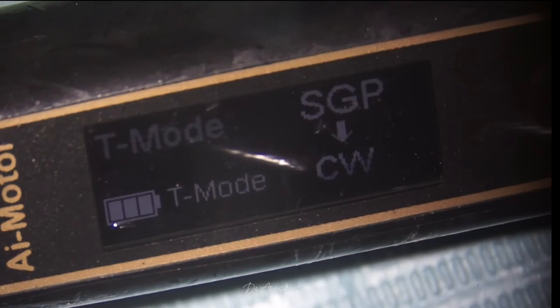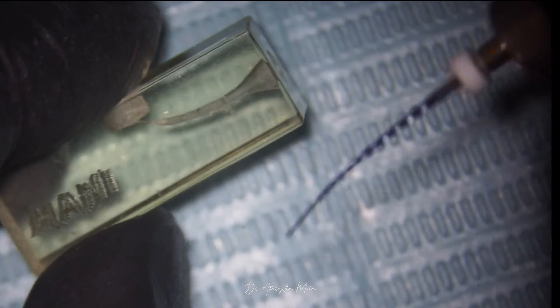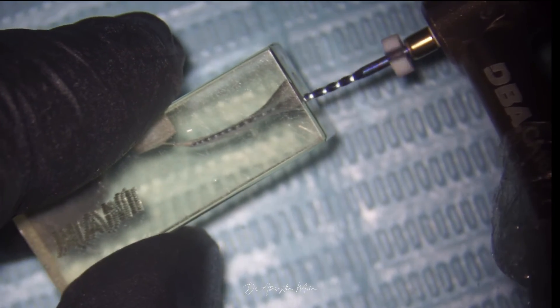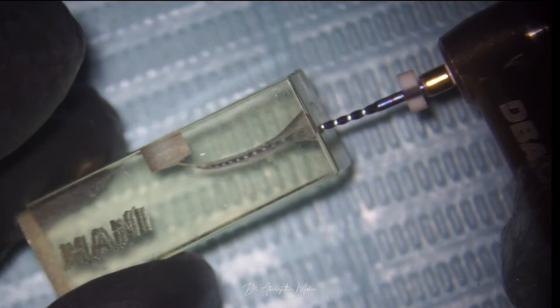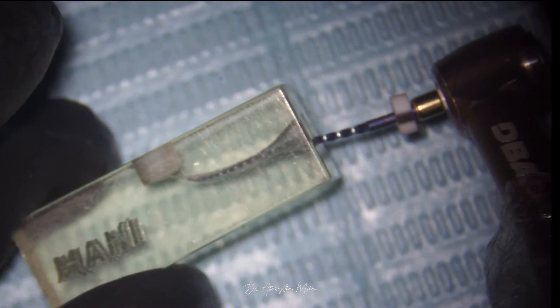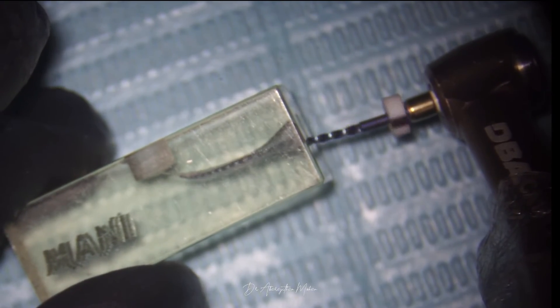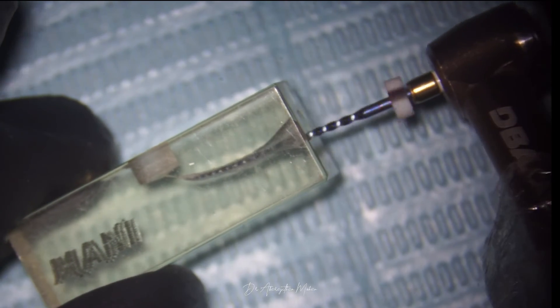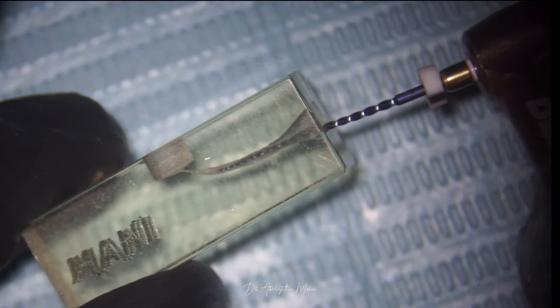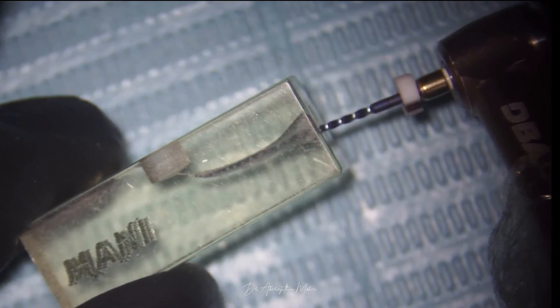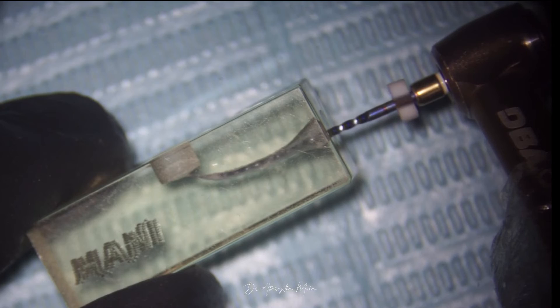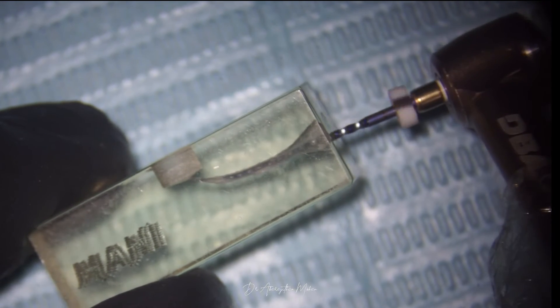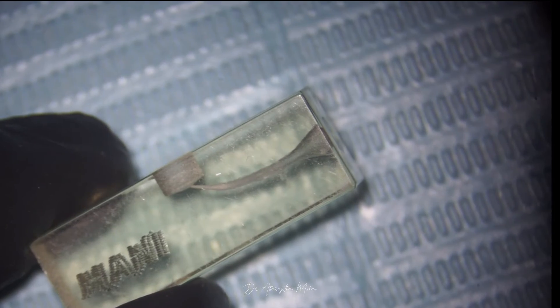Now let's challenge the T-mode by trying it on an artificially created ledge in an acrylic block. I chose an acrylic block with a curvature, intentionally created a milder ledge, and used a size 17 rotary file in T-mode. I could see the file slowly able to come back to the original canal from the ledge because of its reciprocation motion. Once I felt the file had entered the canal, I pressed the switch once again so it became continuous rotation, and you can see the file easily preparing the rest of the canal, eliminating the ledge. This T-mode seems to work for milder ledges.